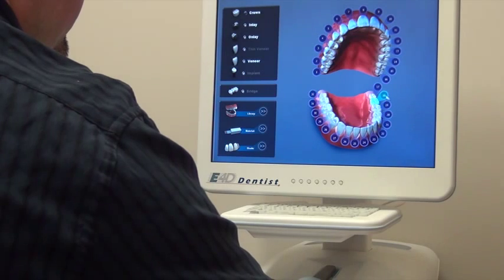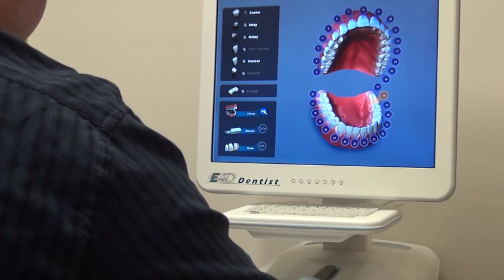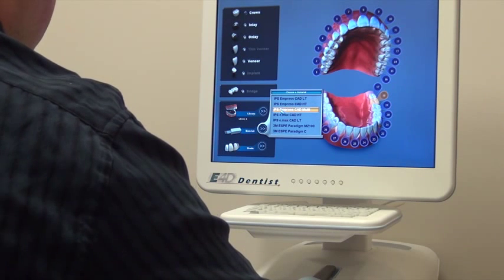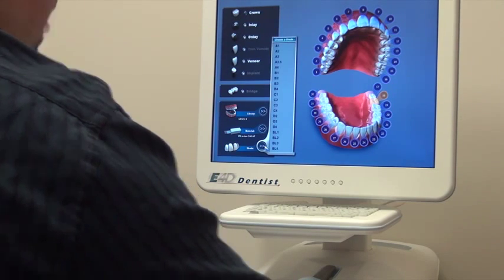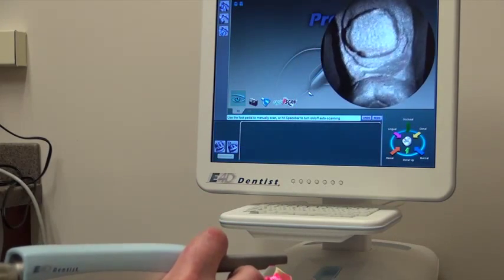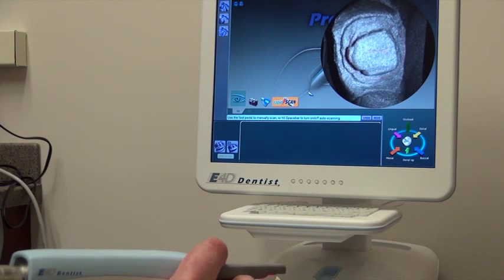Punch in your information and select the tooth that we're working on, which is tooth number 18. Go to the library and pick out a tooth type. We're going to be making it out of an E.max high translucency block. We'll pick the shade and hand that in. The first step is to pull it up on the computer and scan that information in.